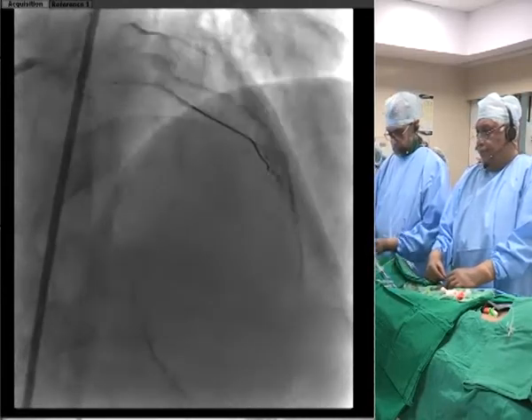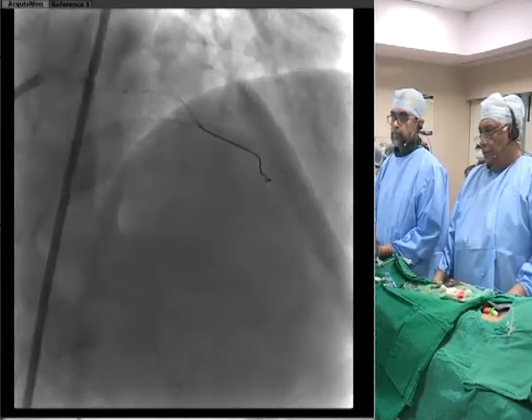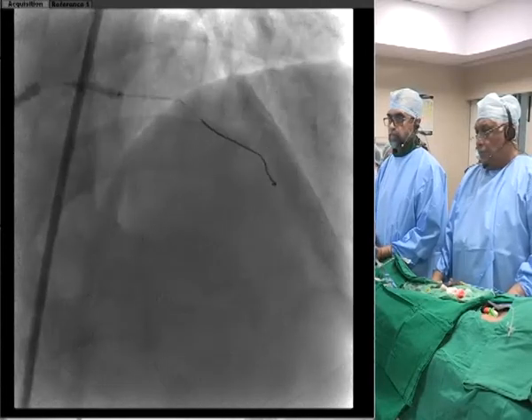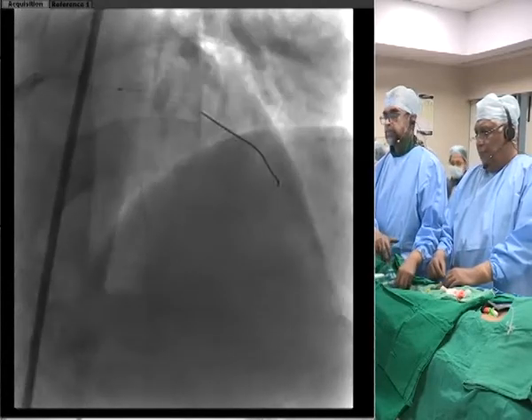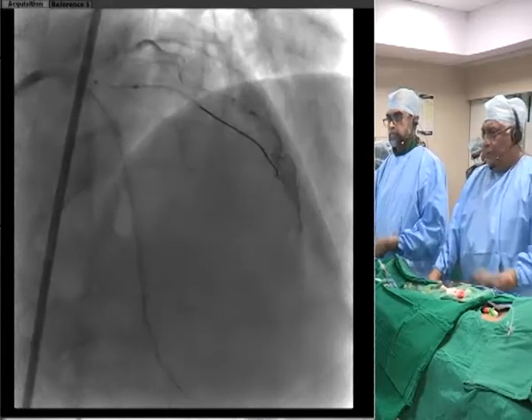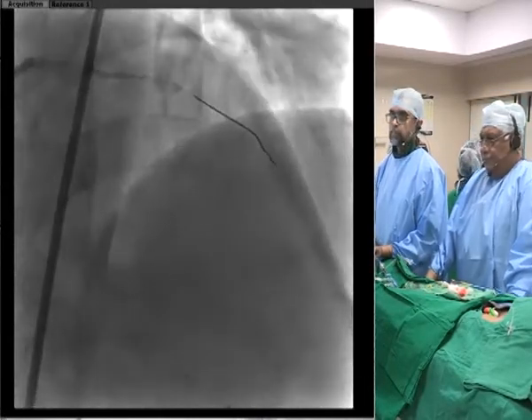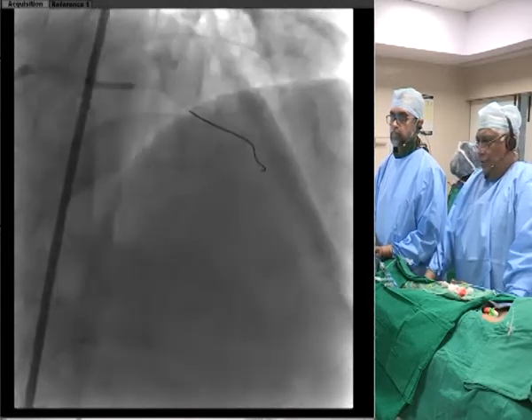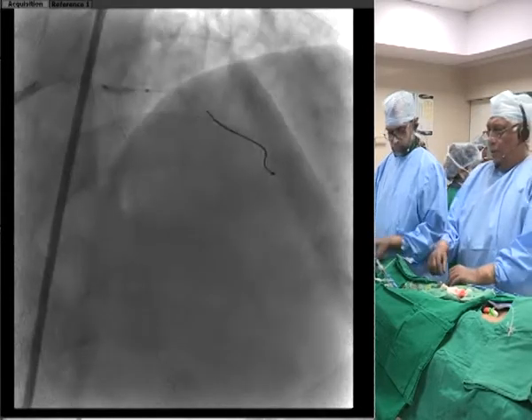Go ahead. So I see that you're dilating into the diagonal. The lower limb of that you're going to leave alone, is that right? Yeah, that is too small. Go ahead. So this is a 2.0 non-compliant Mosaic? Yeah, this is a 2 non-compliant Mosaic.